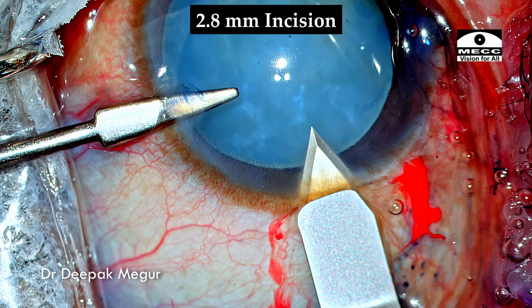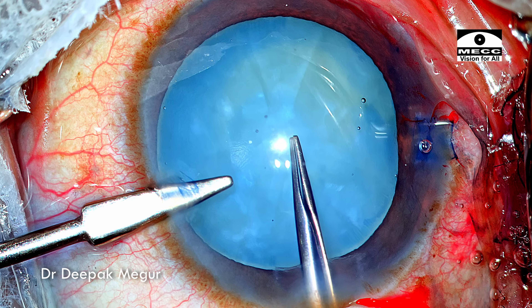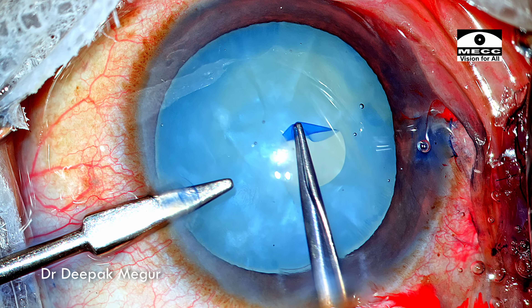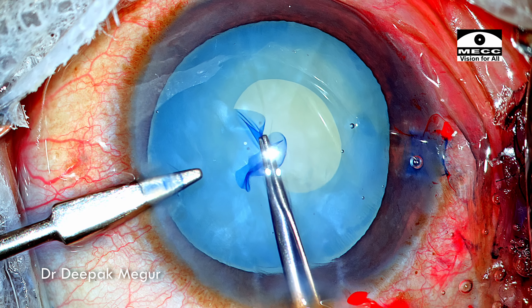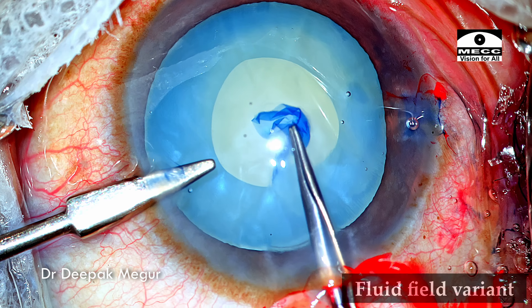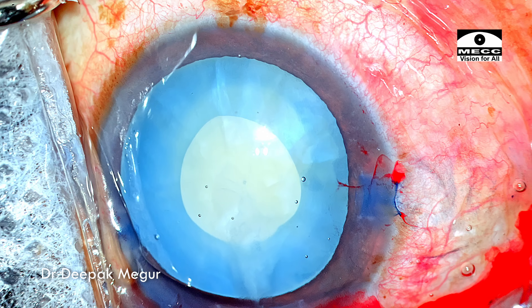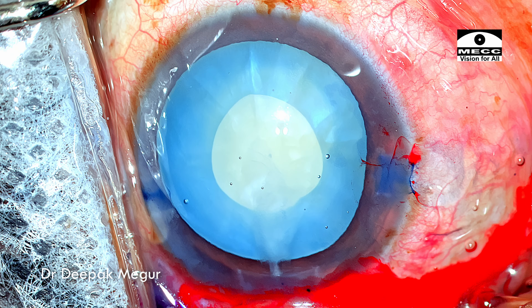The plan is to perform a two-stage rhexis. My primary aim is to ensure that I don't lose the rhexis during the initial primary rhexis itself. As soon as I puncture the capsule, the flap is opened up — it's quite a big flap. I hold it and consciously use both the tearing and shearing technique as the rhexis is being completed. I'm realizing that the control of the capsule is quite good, so I don't have any fear of losing it. This intumescent lens is of the fluid variant, I believe, because as the rhexis is getting completed we can see the liquefied fluffy cortex just coming out. Spontaneous decompression had already happened — that's the reason why the rhexis is not running away.